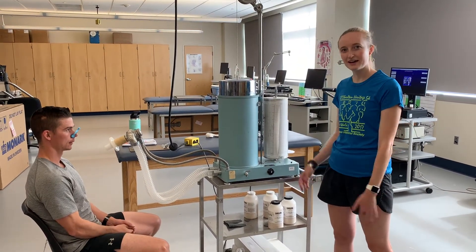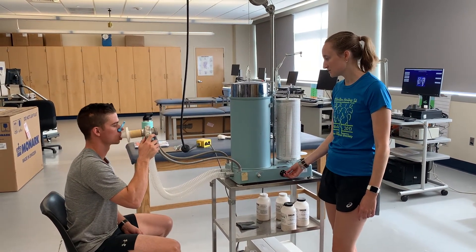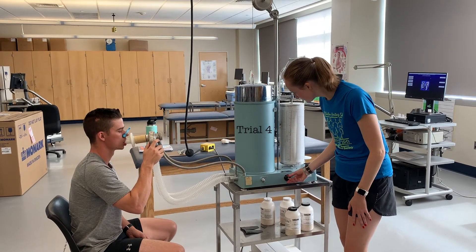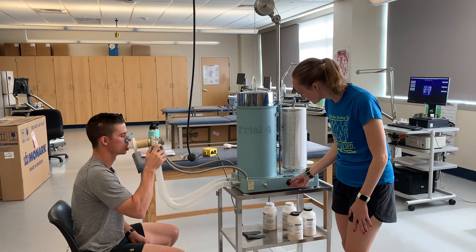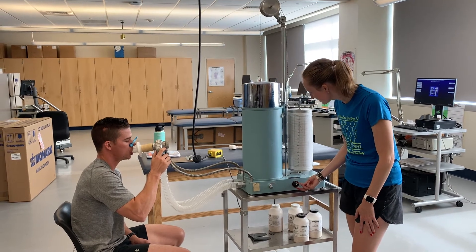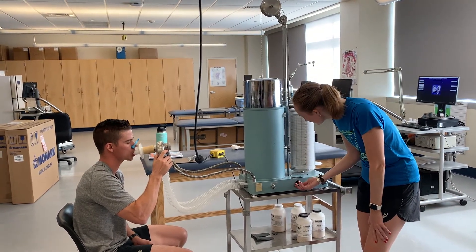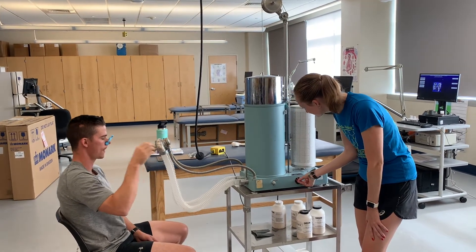We're just going to have Ethan do one more and then we're good to go. Whenever you're ready, start with those normal inhales and exhales. Whenever you're ready, inhale all the way, fill those lungs, and blast out — keep going, push, keep going. And you're good. Nice work.